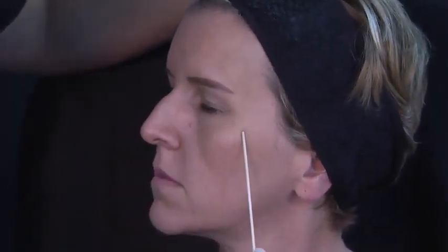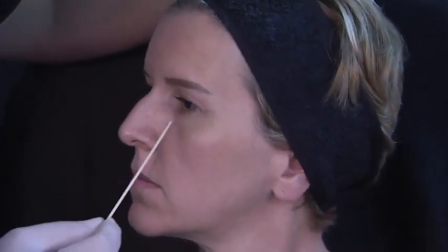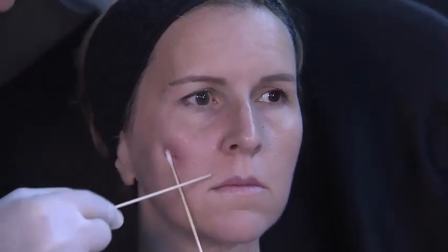Yeah, it's pretty obvious on the big screen. Okay, here, so we can see the other side. We can see clearly how she needs the volume. If I had started lateral in this case, we would have needed a lot more product in this area. And look at the tear trough. We have already improved 80% of this tear trough. Absolutely, we can see it marvelously here. Yes. Again, indirect improvement of the tear trough, indirect improvement also of the nasolabial fold.